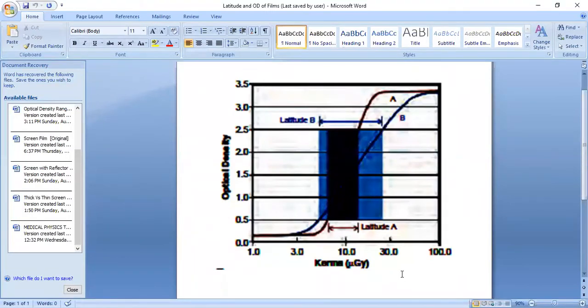You now need to be altering the exposure level. At the end of the day, one will just unnecessarily overdose the patient, and of course, because you are retaking, you are wasting a film. It also amounts to economic waste. So for that, it is good to use the right film.